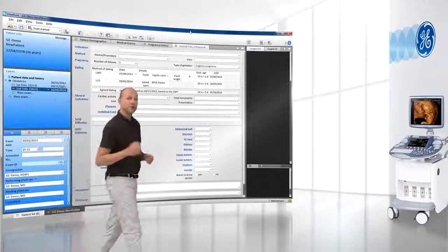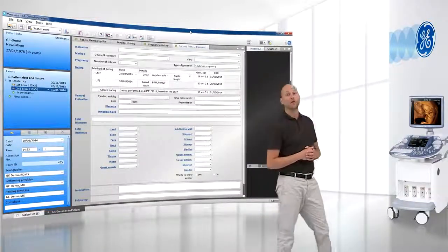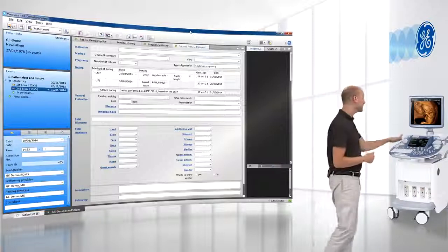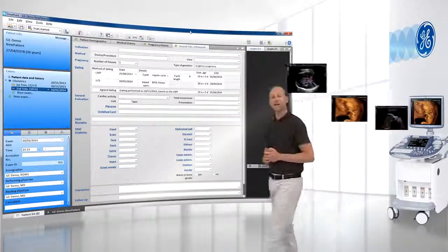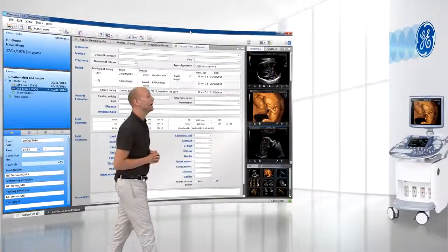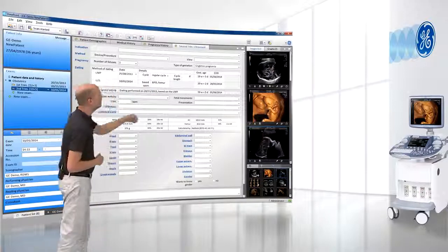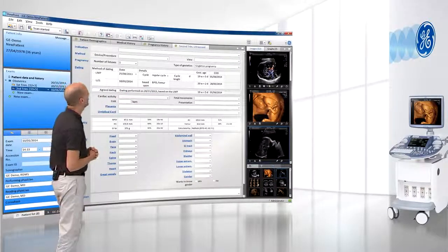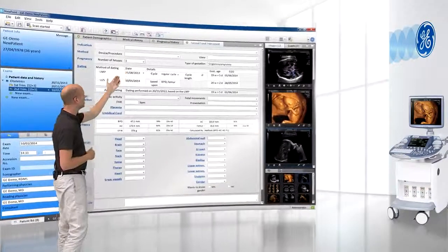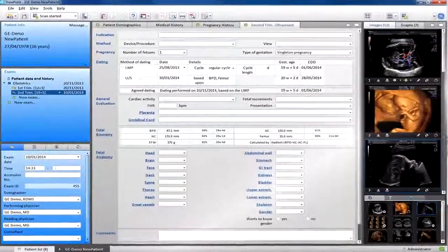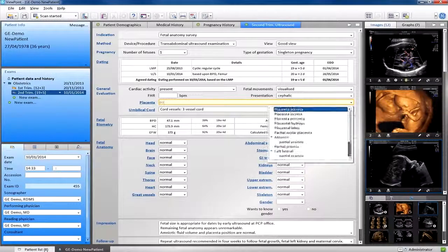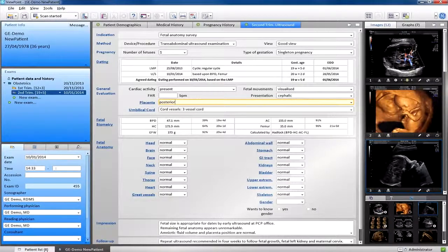Let me now show you how quick and easy it is for you to create a report in Viewpoint. First, with the press of a button, I will send my ultrasound data to Viewpoint. As you can see, images and measurements appear automatically. I then apply a quick report to fill the report with a standardized text. Of course, I can still add or change any part of the report text.